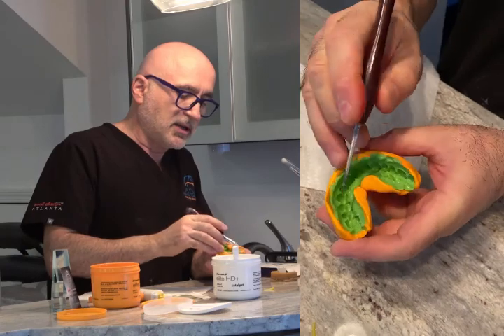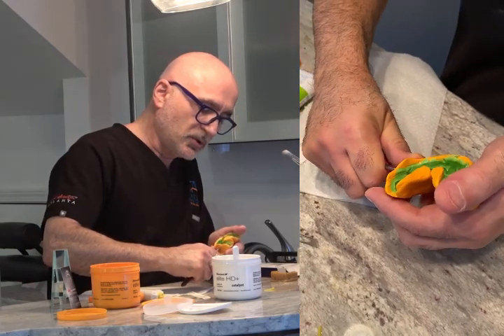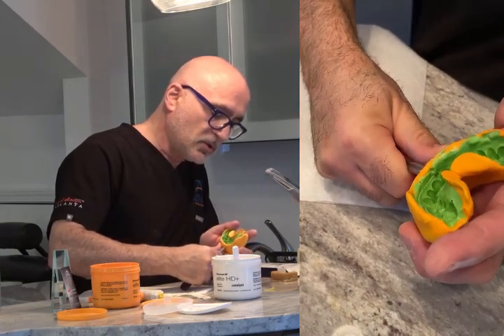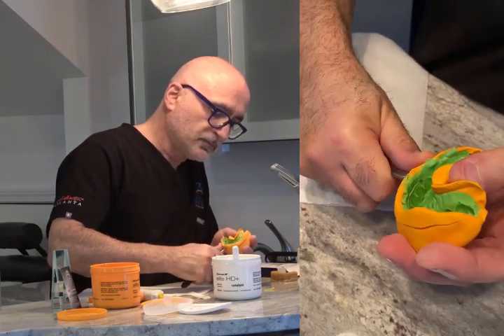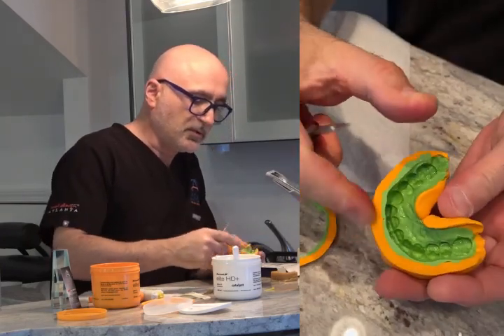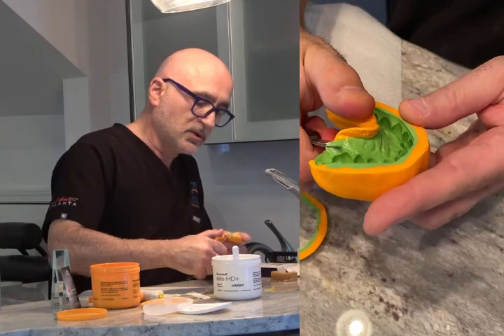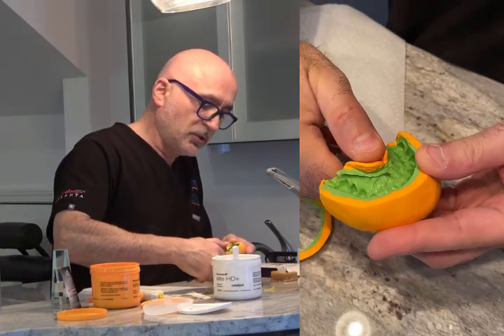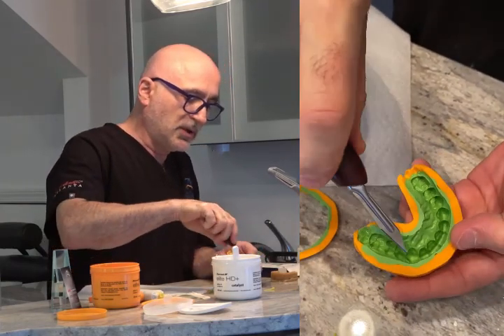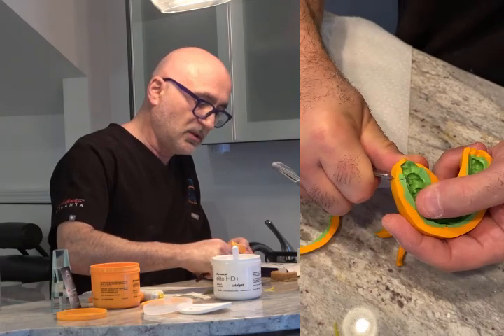Watch where the cervical area is and I cut a straight line first, then do that little CEJ exposure. I'm watching inside so I don't cut too much. All the way straight — I just worry about straight for now. Then I cut and keep enough palate here for support, especially when you have no teeth left. But this one is only 10 units, so the neighboring teeth support it. I cut this one straight as well. Doing 10 units, I'll keep one extra tooth or half of it here as an index so it stays stable when you try it in.